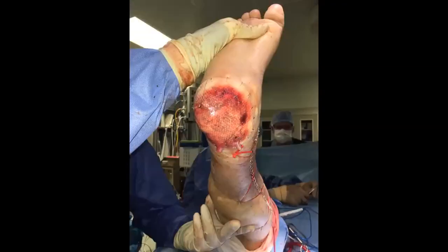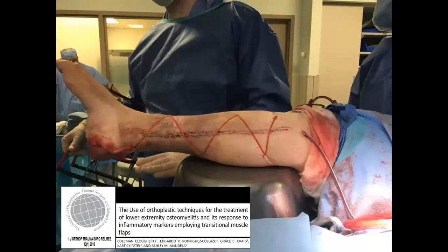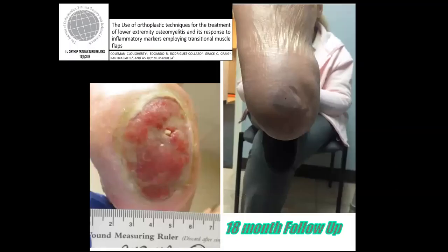So here you can see her void is completely covered. The anesthesiologist is awaiting us saying we're done. But we stabilized that first with an external fixator. This is just showing the incision for the flap itself to harvest the medial portion of the soleus muscle. This just shows her after her flap, at 18-month follow-up.